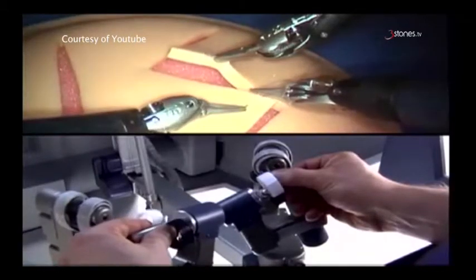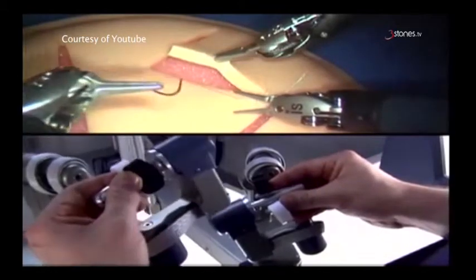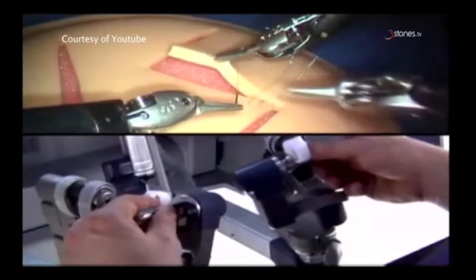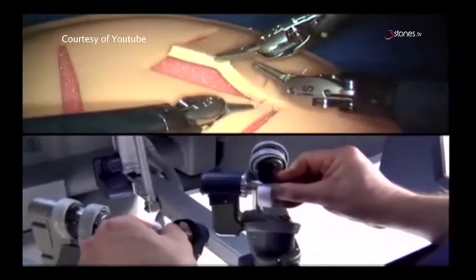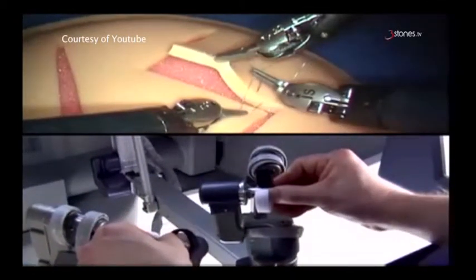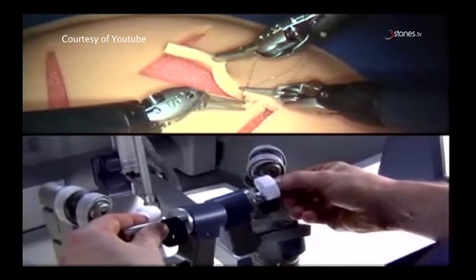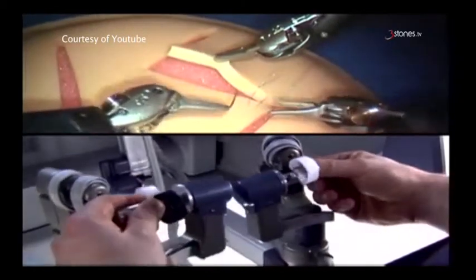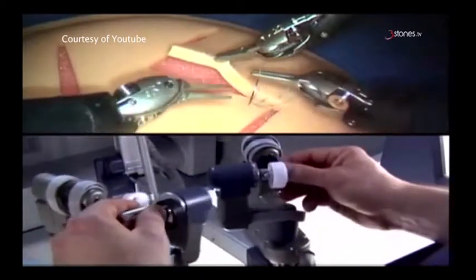The Da Vinci system also provides motion scaling that enables the surgeon to tailor the ratio of his hand movements to a corresponding micro-movement at the instrument tip. The system requires that every surgical maneuver is under the direct control of the surgeon. Redundant safety checks prevent autonomous movement of the instruments or the robotic arms.